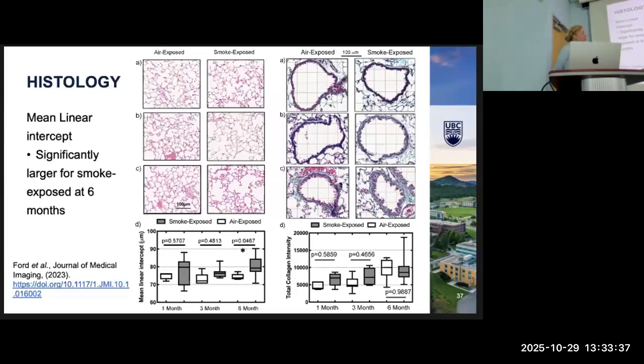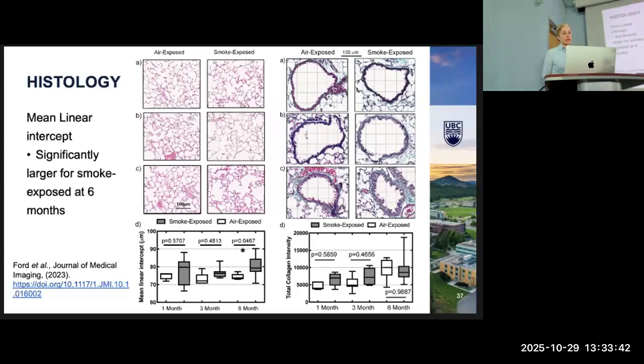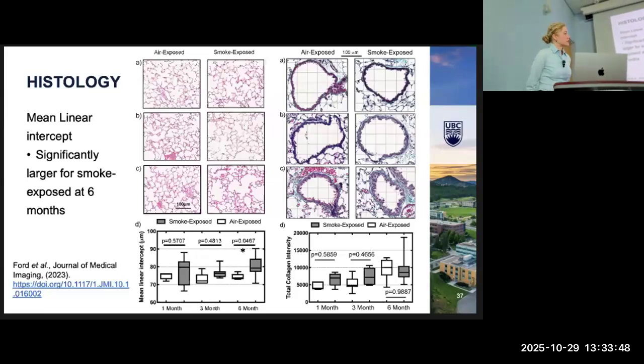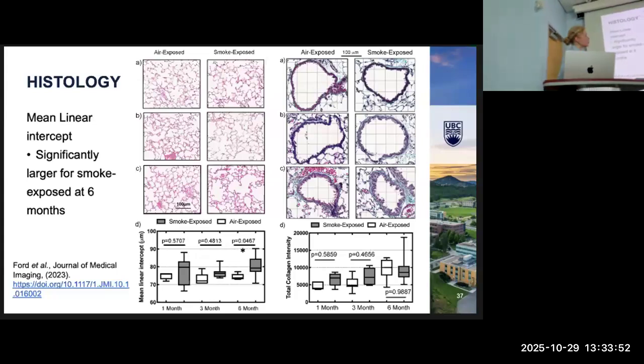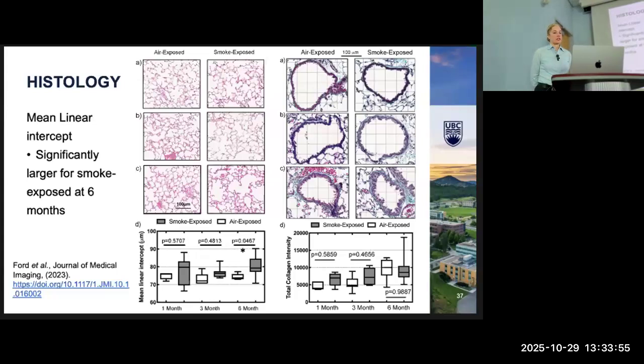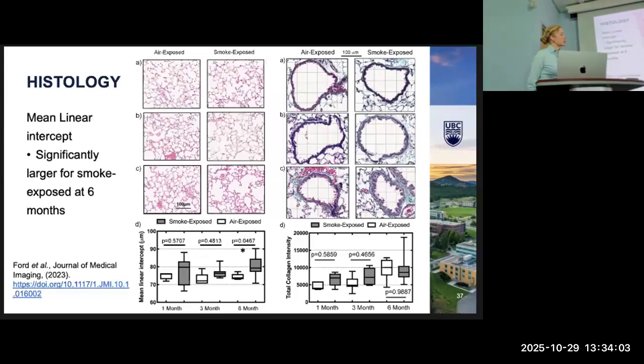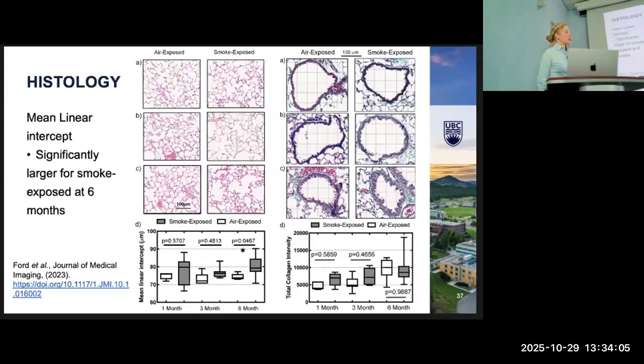On the far side, we have our trichrome stain. In our trichrome stain, the brown color is the nucleus of the cell, the reddish color is the muscle, and the bluish green color is collagen or fibrotic tissue. You can see that there are a few differences as we go down from 1 to 3 to 6, but not a huge amount of change.